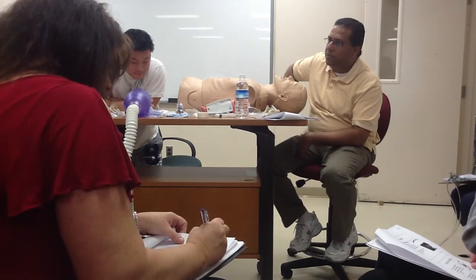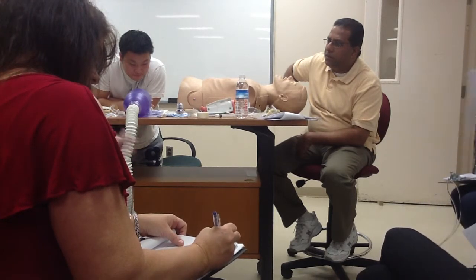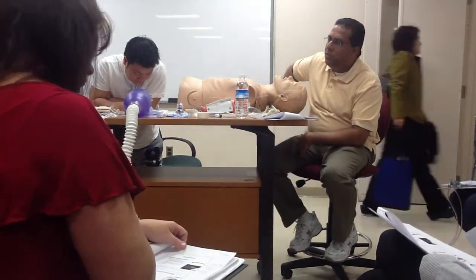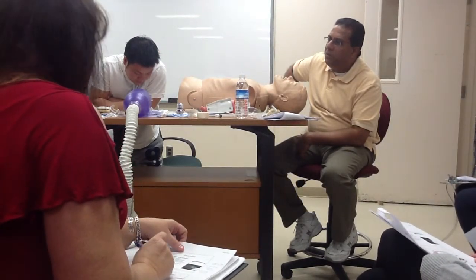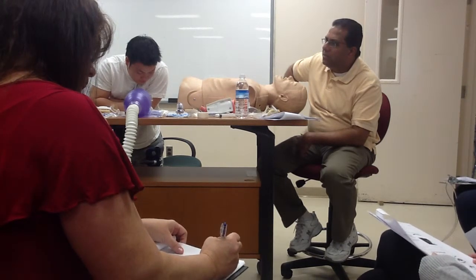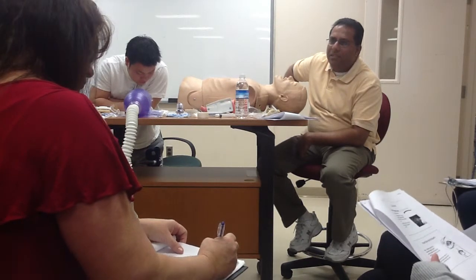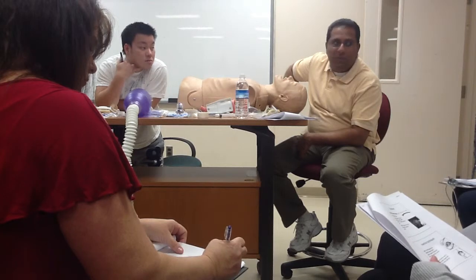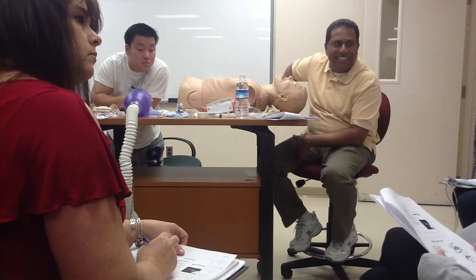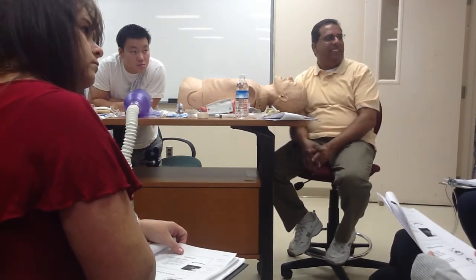If the patient is a frequent suctioner and needs it every day, how long would you leave that in? You're supposed to remove it after 24 hours and replace it with a new one. You can switch sides too, and put a new one in, otherwise it gets all nasty. Plus, it could have leftover mucus that's getting dried in it, and you can't see it.